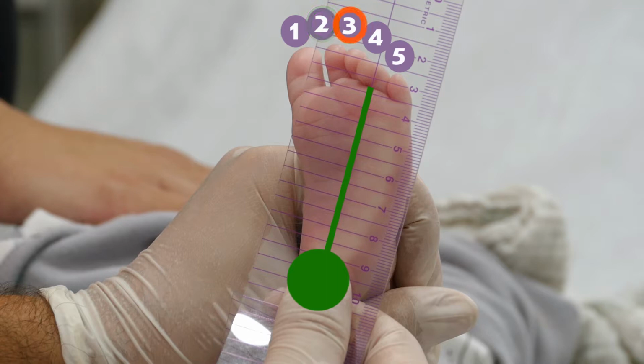If it points towards the third toe, then the severity is low. Towards the fourth toe, moderate severity. Towards the fifth toe, high severity. In our case, the ruler points between the fourth and fifth toes. According to this parameter, the examination result is moderate to high severity.